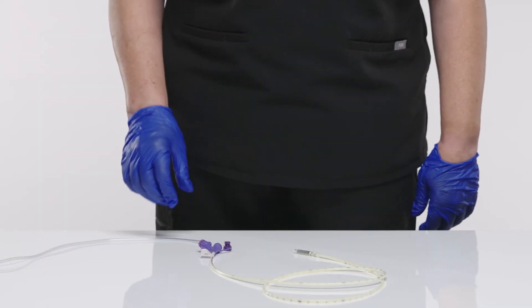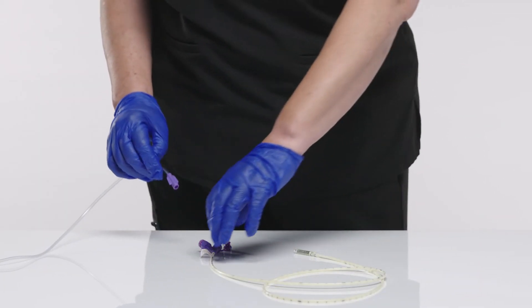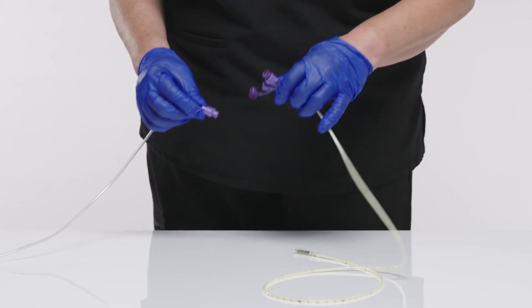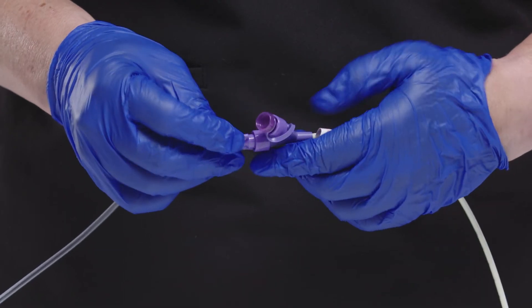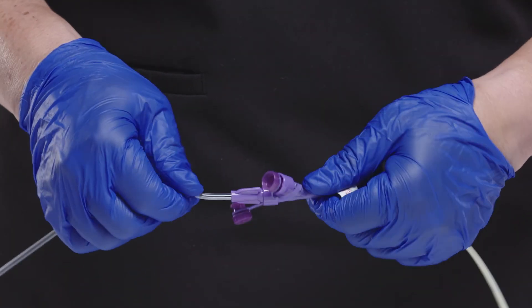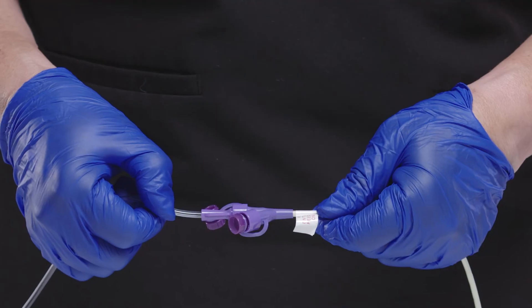Enteral feedings may begin by filling the enteral feeding bag, purging the tubing of air, and connecting it to the feeding tube. Be sure to connect the feeding bag to the vertical Enfit connection for optimal flow rates. Again, take care not to over-tighten the Enfit connection.